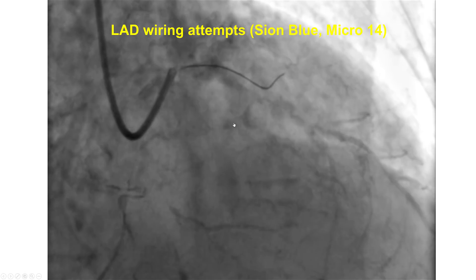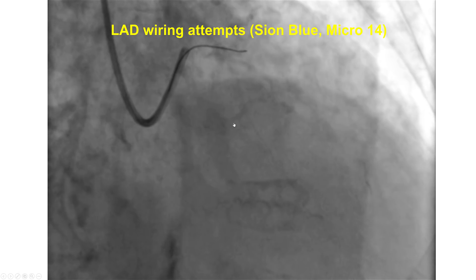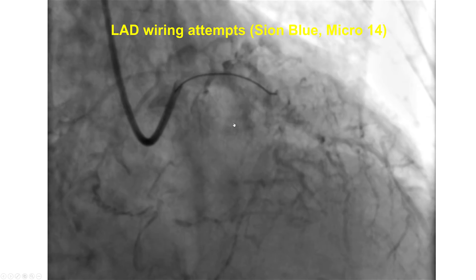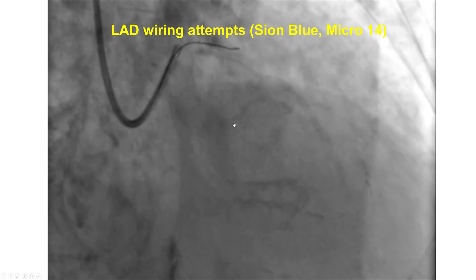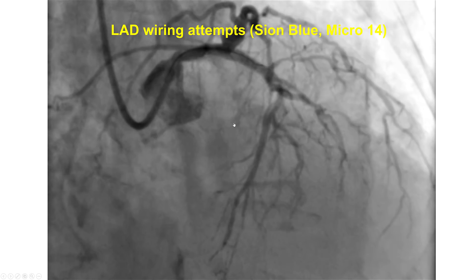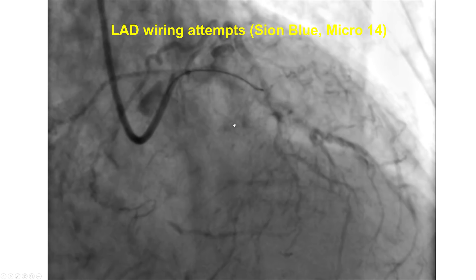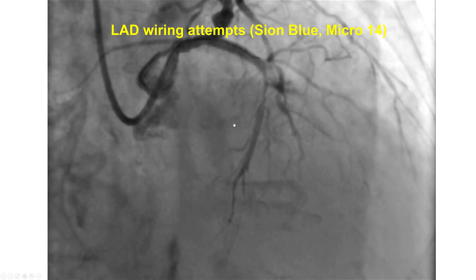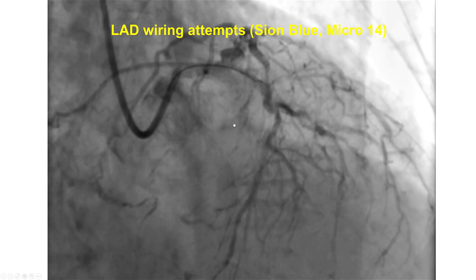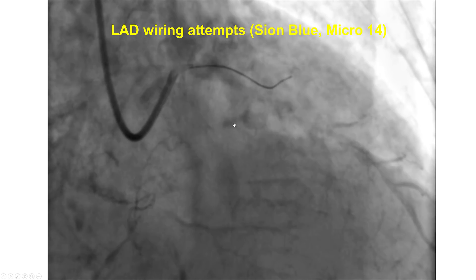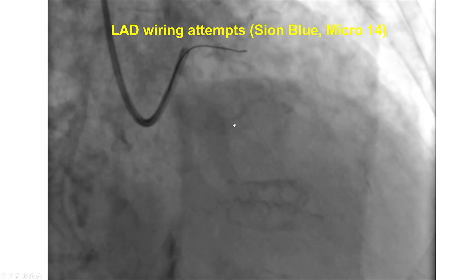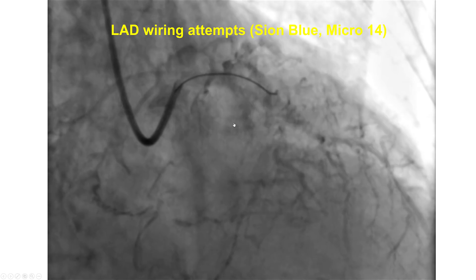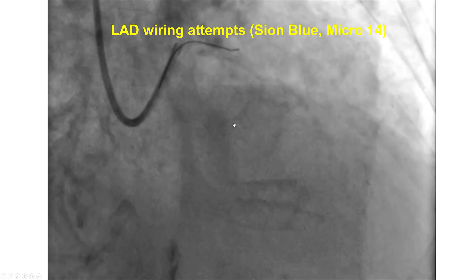This is obviously a complex lesion because of the severity and its proximity to a major bifurcation. That is why we used a 7 French slender sheath on the radial and also used a microcatheter upfront together with a workhorse guidewire.